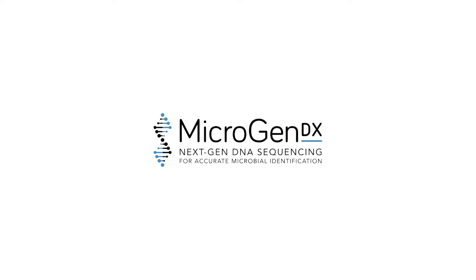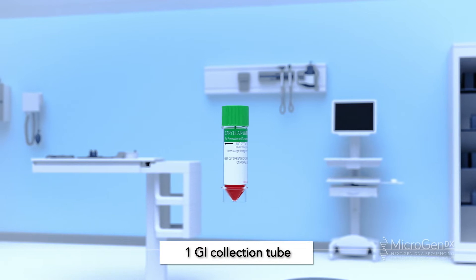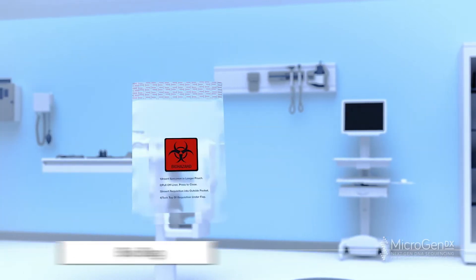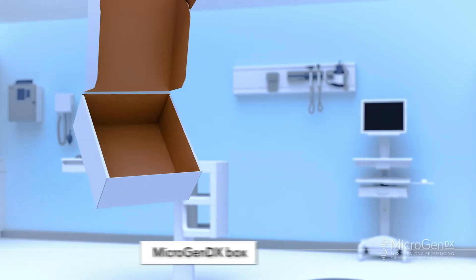MicroGen DX Collection Instructions: Stool Sample Collection Method. The MicroGen DX Collection Kit will include one GI Collection Tube containing Cary Blair Medium with Indicator, a Bio Bag, a Lab Requisition Form, and a MicroGen DX Box.